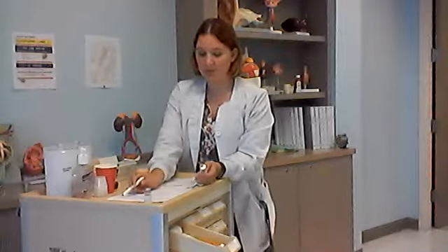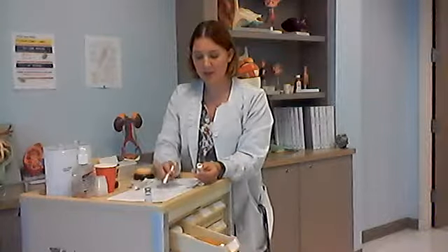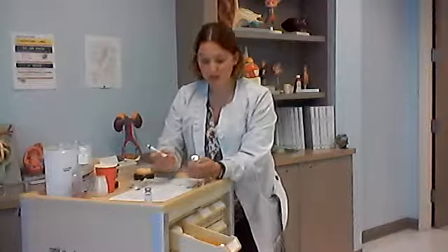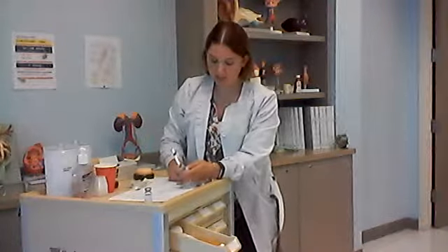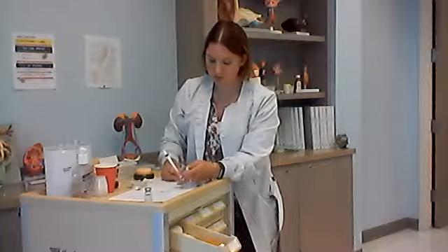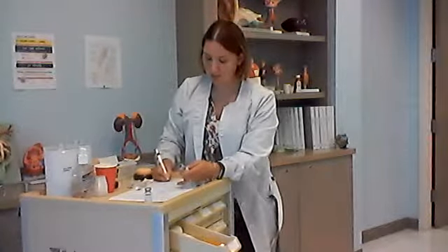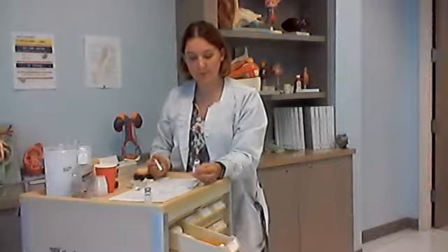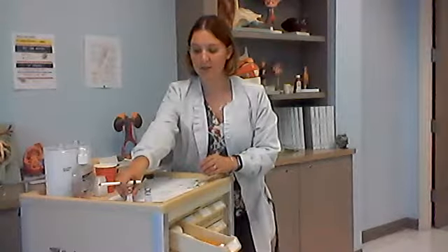So I'm going to verify Terrence Walker, 15461, hydralazine, 50 milligrams, but I only need 25. So again, you're going to have to do some math, whichever method you want to do. I know I'm going to give 0.5 milliliters. So now I know I have the right dose. Route is IM. Time is now. I will document at the end.